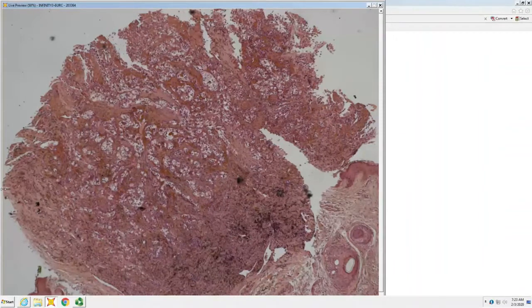And then there are certain antibodies, again, that can be helpful. RCC is fairly specific for renal cell carcinoma. And if you don't happen to have that in your lab, CD10 also stains renal cell carcinoma and is something that pretty much any lab will have. So those are commonly in use. GATA is used for a variety of things, from breast to other tumors. You know, often you have to work with what you happen to have in your lab.